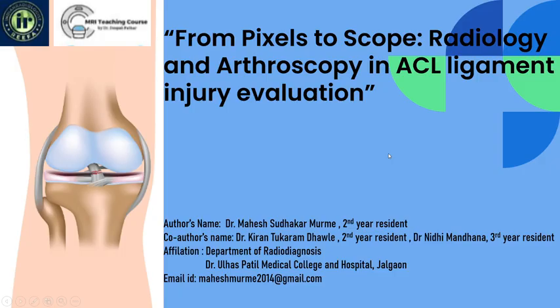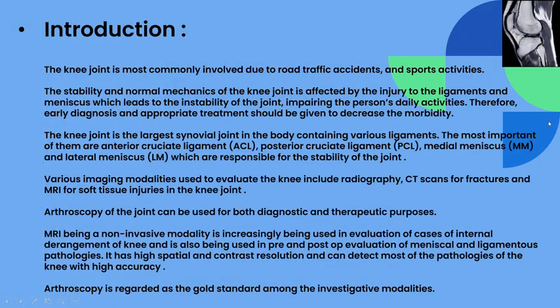I would like to present a poster on the topic named From Pixels to Scope, Radiology and Arthroscopy in ACL Ligament Injury Evaluation. The introduction to my topic is that the knee joint is most commonly involved due to road traffic accidents and sports activities. The stability and normal mechanics of the knee joint are affected by injury to the ligaments and meniscus, which leads to instability of the joint, impairing the person's daily activities. Therefore, early diagnosis and appropriate treatment should be given to decrease the morbidity.